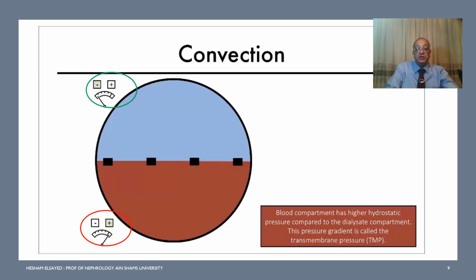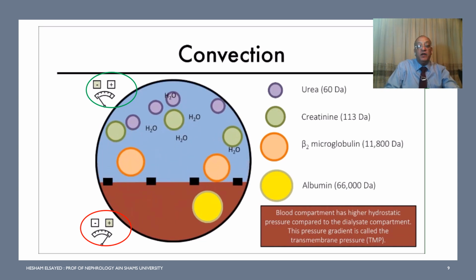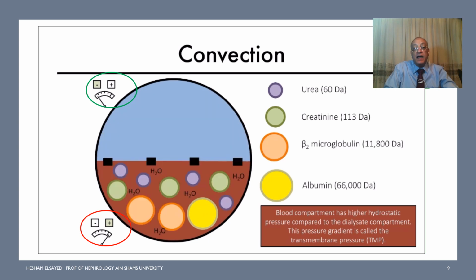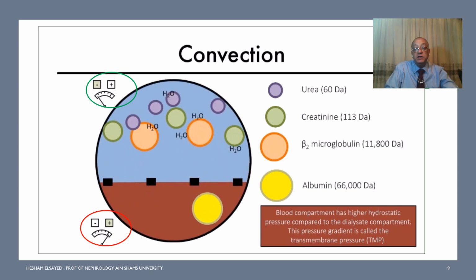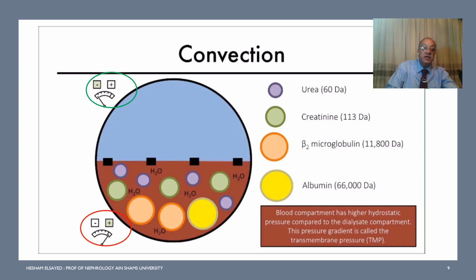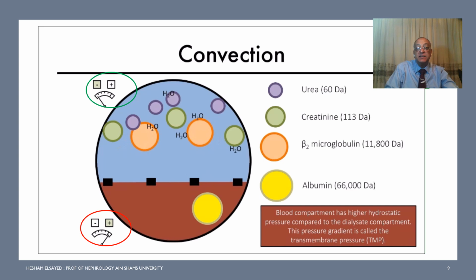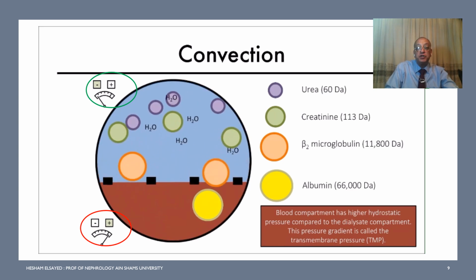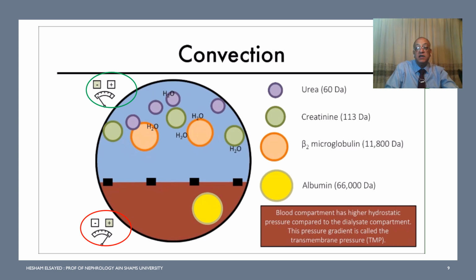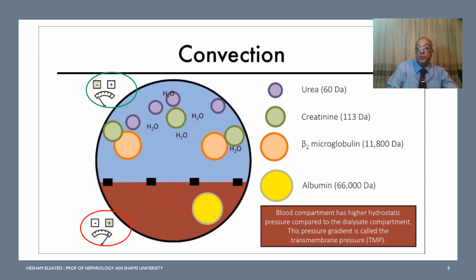A dialyzer should perfectly have convection because convection enhances the removal of middle molecules. So a dialyzer with a higher ultrafiltration coefficient should be used in high flux or in hemodiafiltration to have water removed besides the middle molecules, optimizing that against the transmembrane pressure. So any dialyzer choice should have both convection and diffusion criteria optimized.